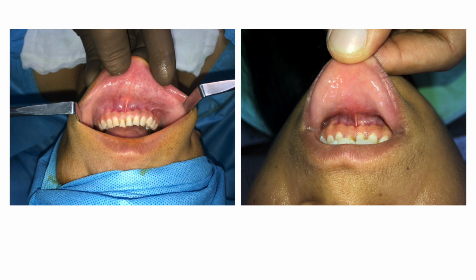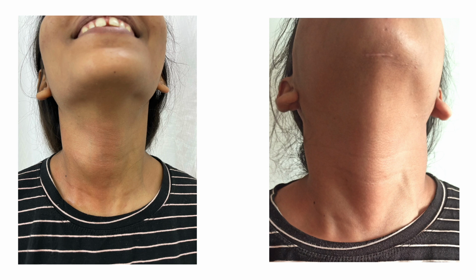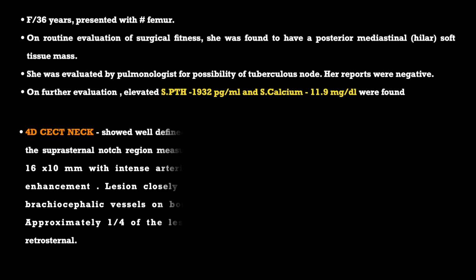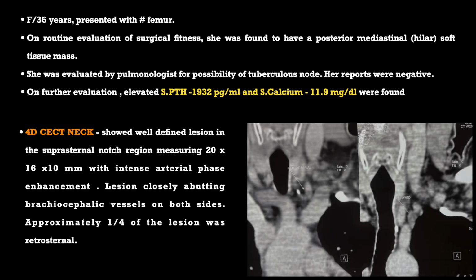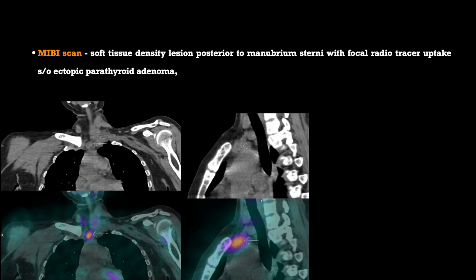The post-operative excellent cosmesis of the mucosal and the neck skin is well evident. In a similar fashion, endoscopic parathyroidectomy for a benign parathyroid adenoma can be performed transorally. Herein, a case of an ectopic right inferior parathyroid adenoma is shown.